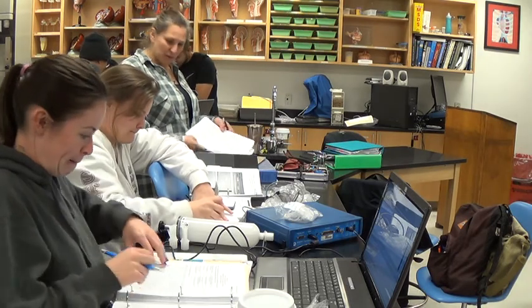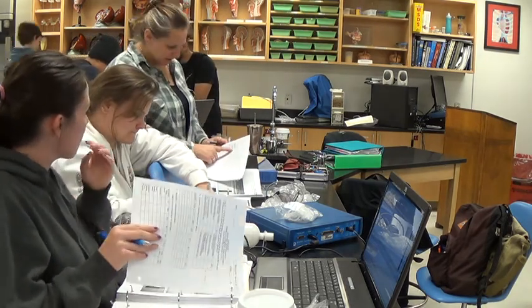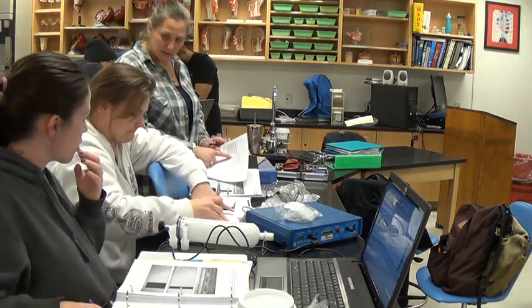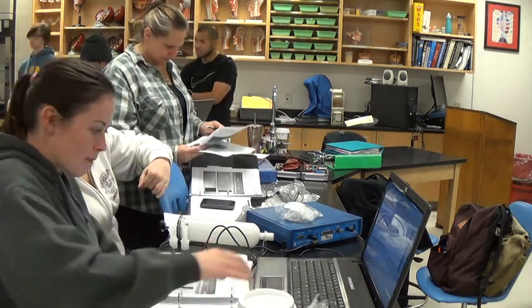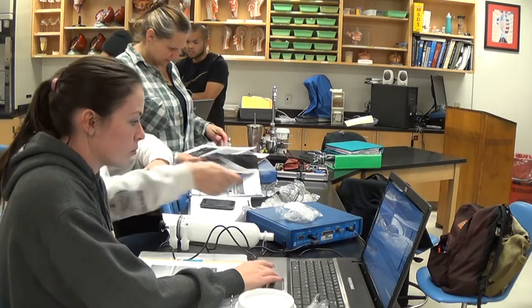So with these values, make sure I got all these right. Tidal volume of... let me try calculating our tidal volume again. I don't know, I would have to do them over again. Let's just do them over again. Yeah, let's find a smaller peak on hers like this one.